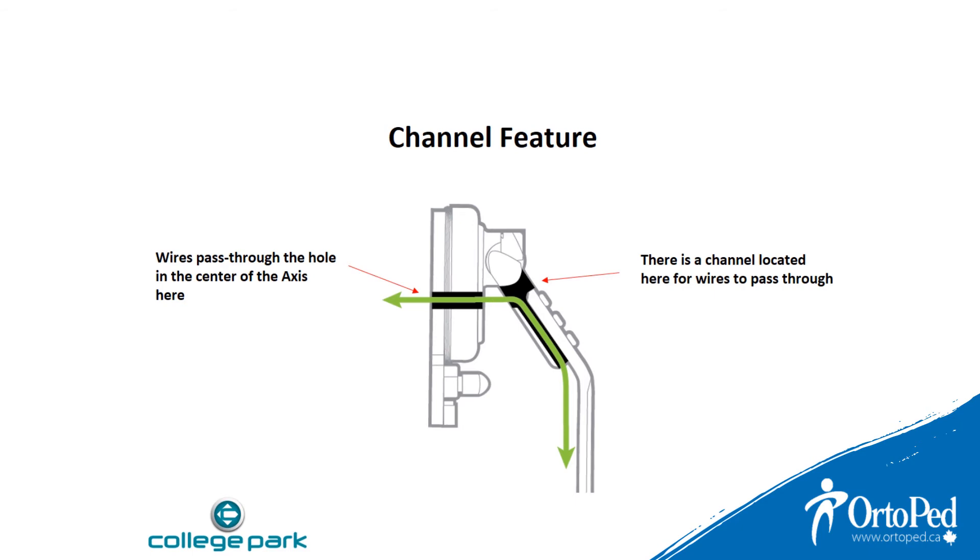The Axis is compatible with myoelectric setup as well. The machine channel feature conceals and protects the power cables. Easily route power cables through the hole in the center of the joint then down the channel of the yoke plate.